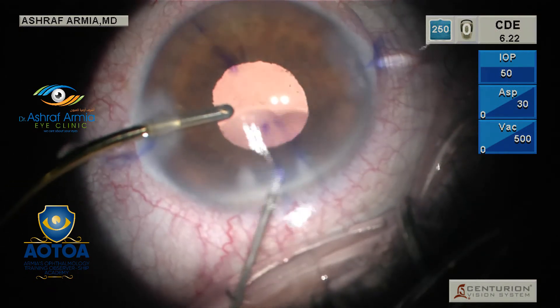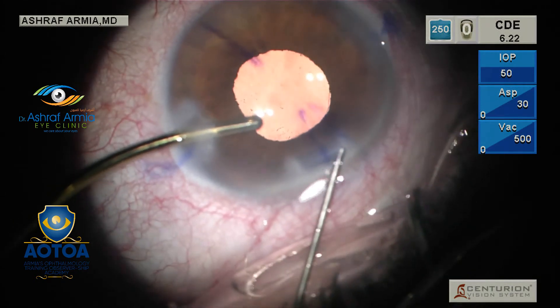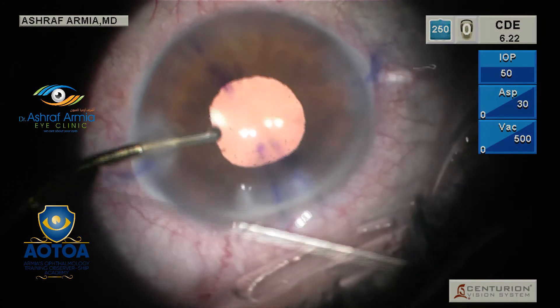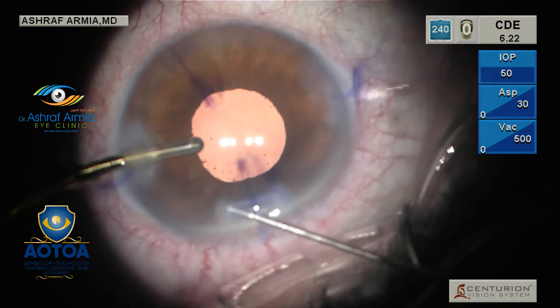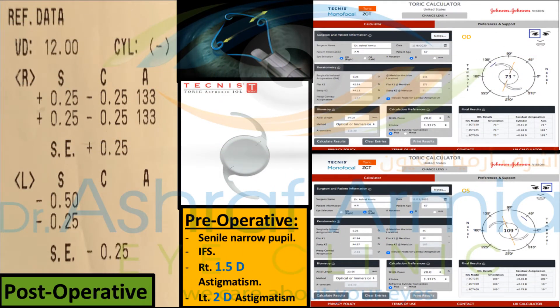Hydration before you remove your irrigation is mandatory to maintain your anterior chamber and preserve the good IOL position you achieved during placement. After finishing the operation, this is how the patient looks post-operatively — he had 1.5 diopters on the right and 2 diopters on the left, but post-operatively we corrected the full astigmatism.